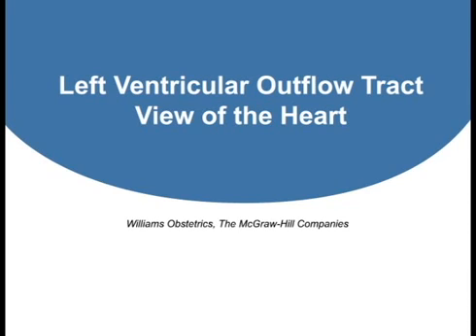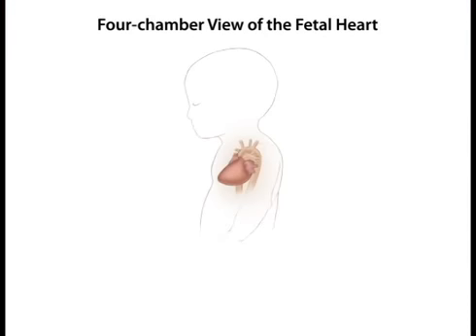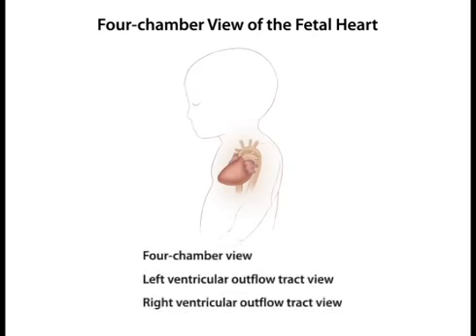Left ventricular outflow tract view. During standard obstetrical ultrasound evaluation, several views are used to image desired cardiac anatomy. The 4-chamber view is obtained during every standard examination. If technically feasible, a left ventricular outflow tract view and a right ventricular outflow tract view are also obtained.